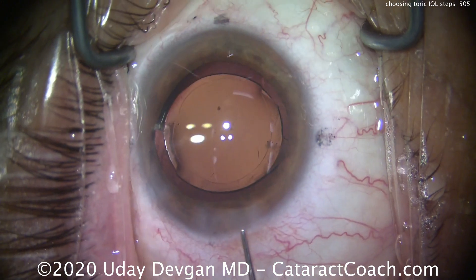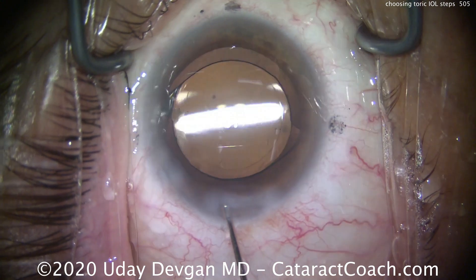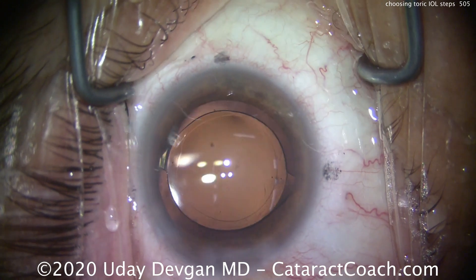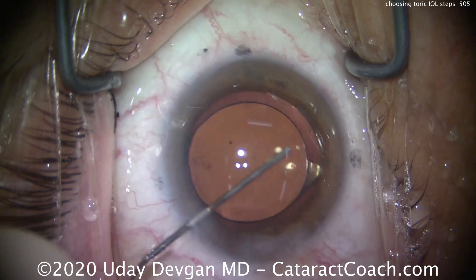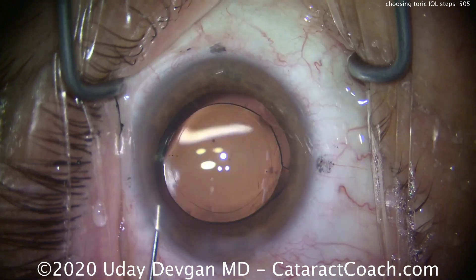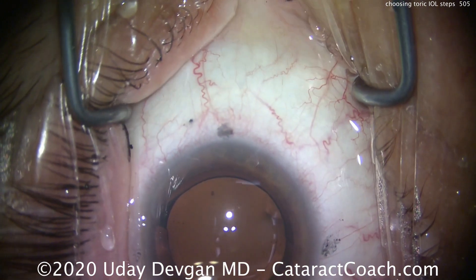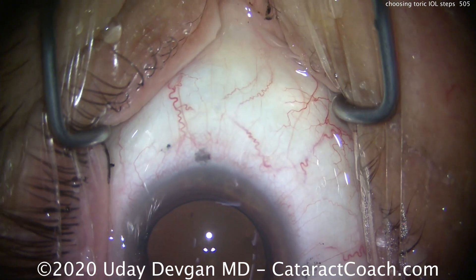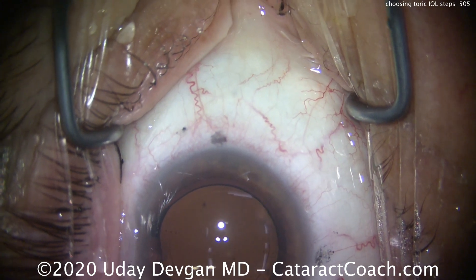Rotation is very important. If you're exactly on the intended axis, you get the full benefit and full power of the toric lens. If rotated by just a few degrees, you start to lose that power. A good rule of thumb: you'll lose about one-third of the power for every 10 degrees of rotation. So a 30-degree malrotation — just one clock hour — results in complete loss of toric benefit.